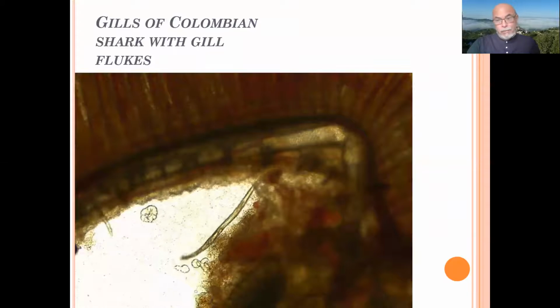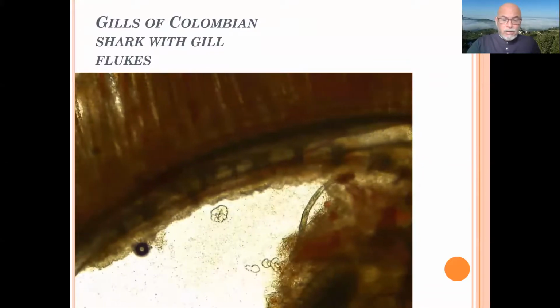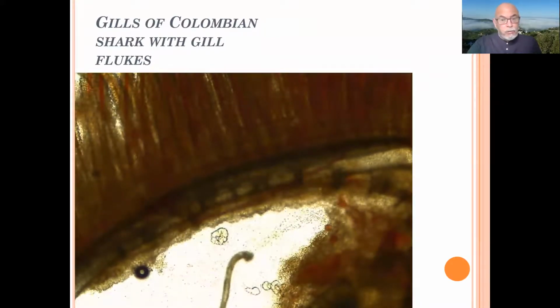Some are moving around. That's what gill flukes do when they are not happy to be on the slide underneath the microscope lamp. They start to move around and try to get away. So in certain fish which are dying, sometimes the gill flukes escape and leave the fish like rats leaving a sinking ship.